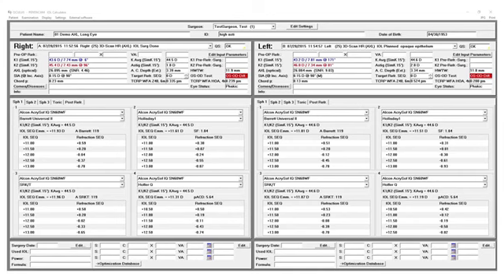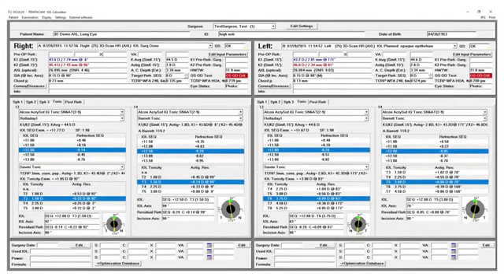For normal corneas, we have the Holladay 1 formula, SRK-T formula, the Hoffer-Q formula, and the Haigis formula. We have also recently added the Barrett Universal 2 formula. For toric IOLs, we have the Barrett toric calculator, and we have also recently implemented the Savini toric calculator, which is designed to utilize total corneal refractive power.